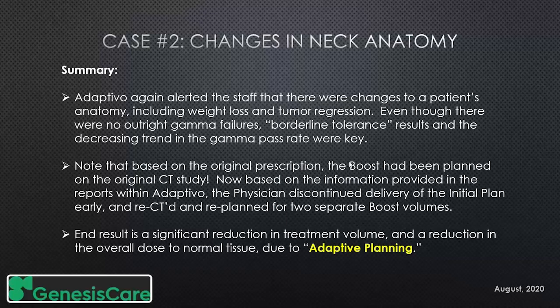If you make it too tight, you get a lot of gamma failures for just daily variations in setup or daily variations due to slight patient motion, which is common on a daily basis. And if you have your constraints too loose, you'll never get a gamma failing. So it's a useless tool at that point. So 80% was chosen by our corporate office through our physics staff there.